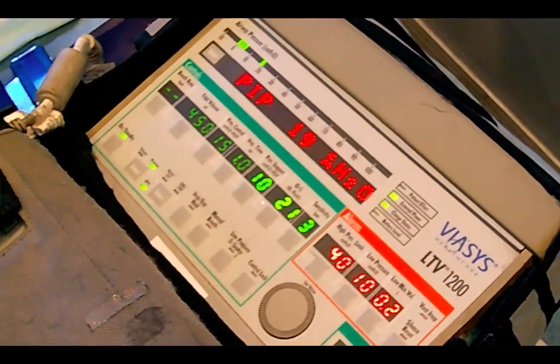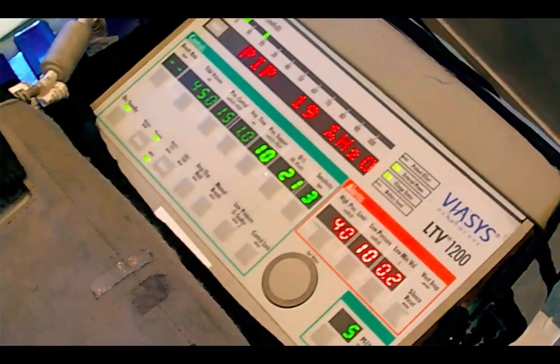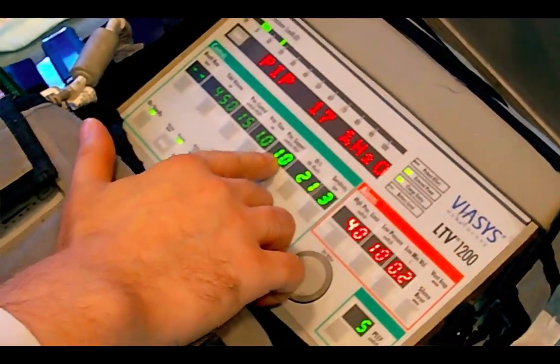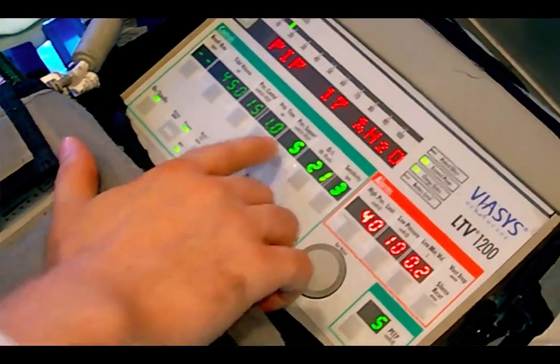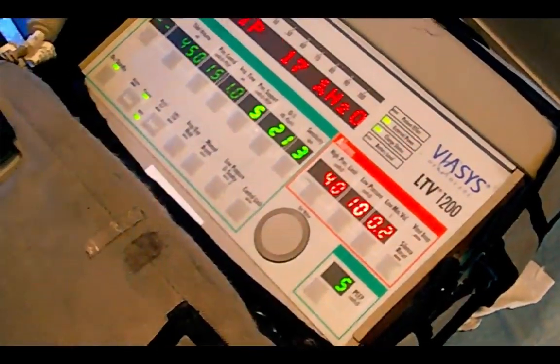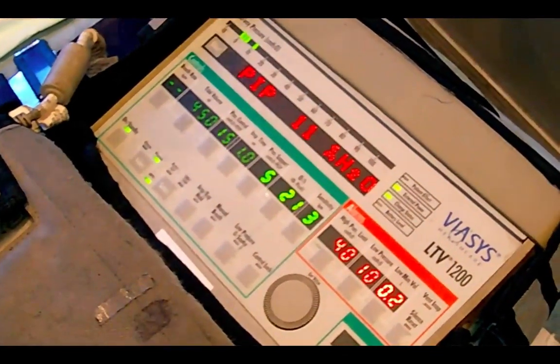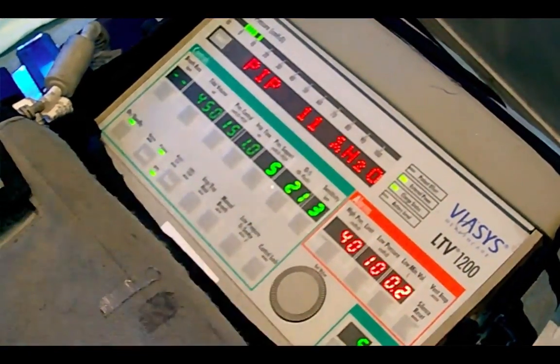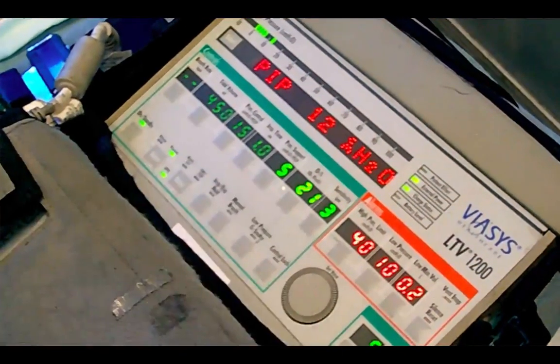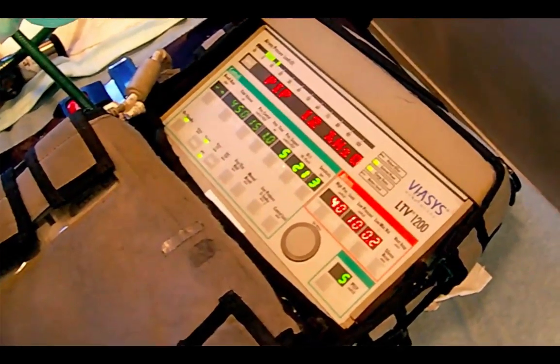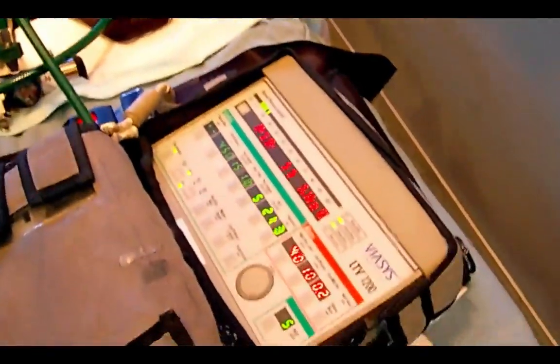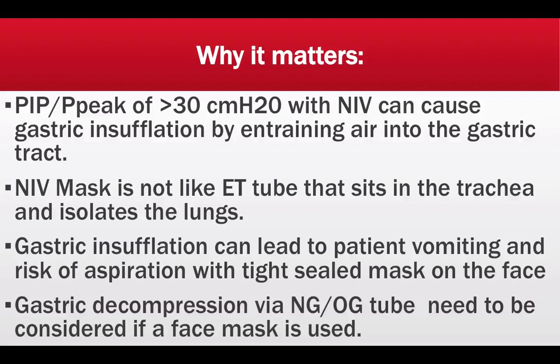It even says so on the top button: 'pressure support plus PEEP' — you can see the additive label right there. So if you came in wanting to set the patient at the same settings as a standalone machine set to 10 over 5, you would have to set this ventilator to 5 over 5 to give you a true 10 over 5. Now you can see when the patient inhales it's 10, and when exhaling it's 5 — because they're additive. If you proceed to set 10 over 5 directly, you will actually deliver 15 or higher, which is the main reason this is so crucial to understand.